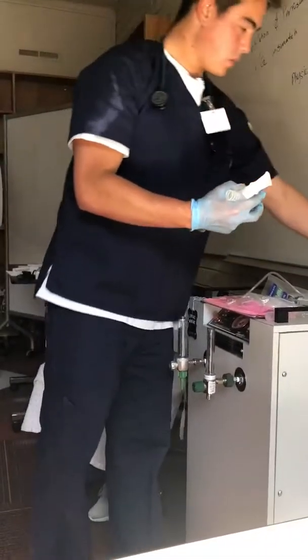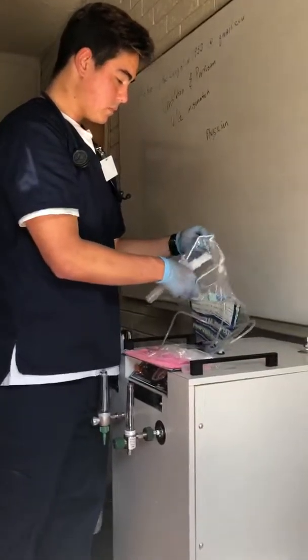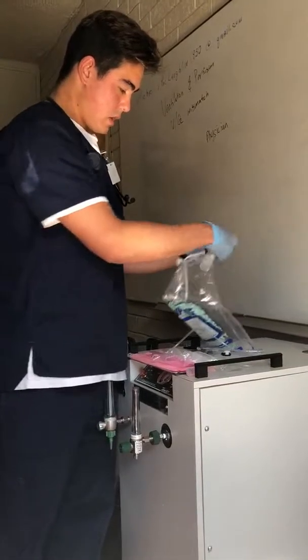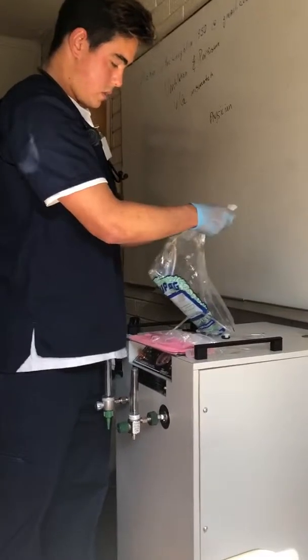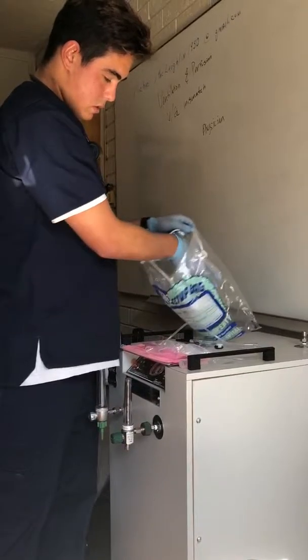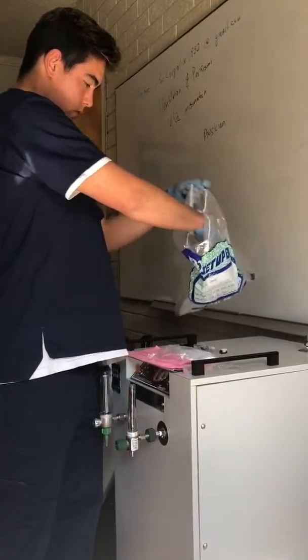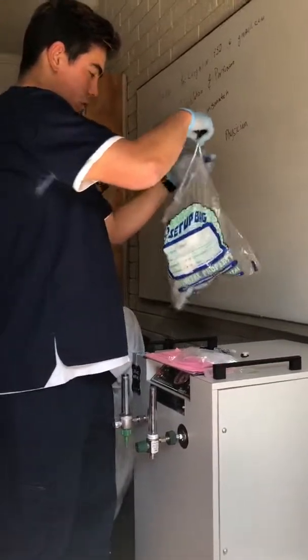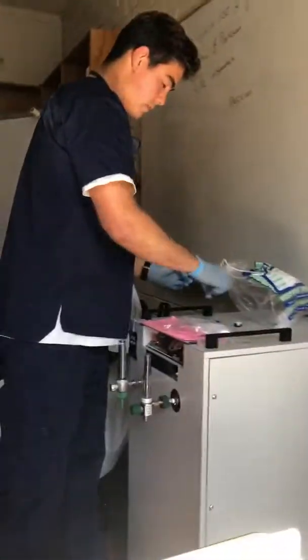It is dry right now, so we're going to go ahead and place it back in the patient's bag for their next treatment. Take it apart completely. Labeled. You can hang this on the patient's bed or in their room for the future respiratory therapist.